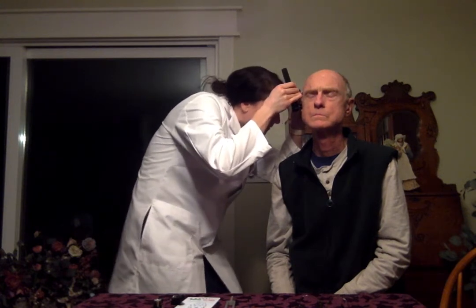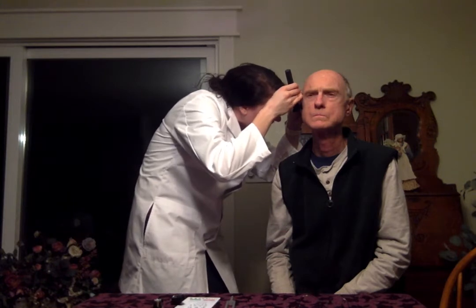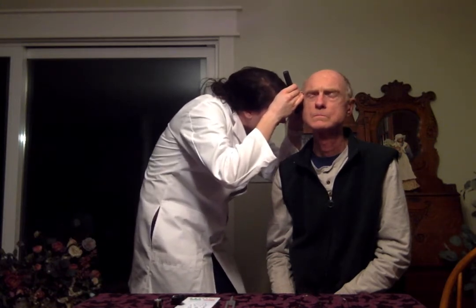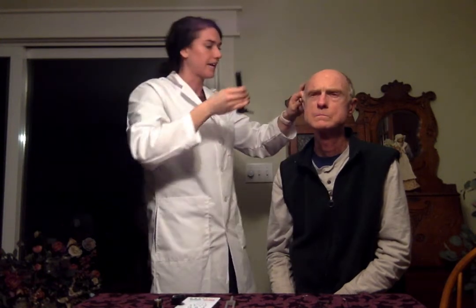So the tympanic membrane is seen. It's a pearly gray color, and I do see the malleus is noted, and the cone of light on the right side is at 5 o'clock. So that looks great. There's no discharge and nothing abnormal in that ear. So I'm going to go ahead and move to the left ear.